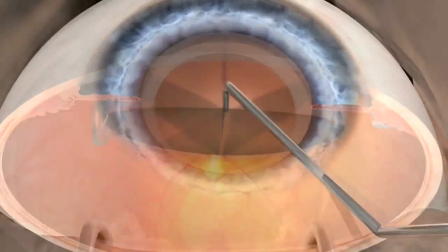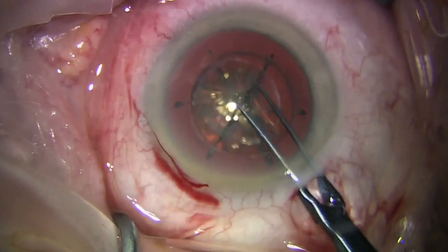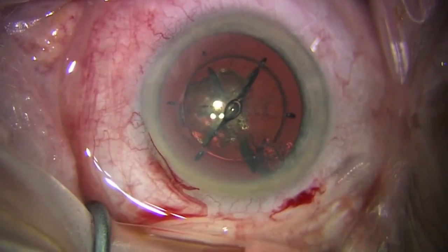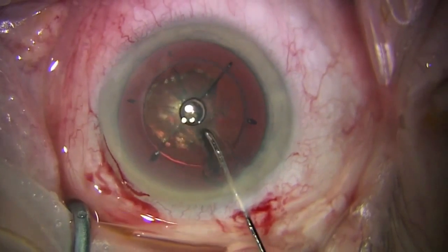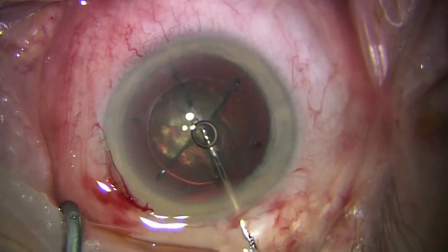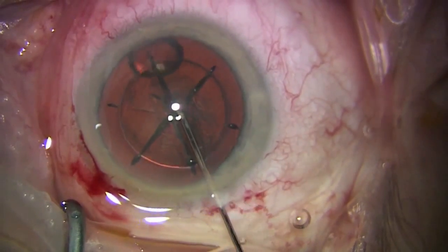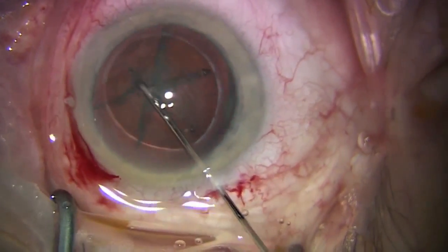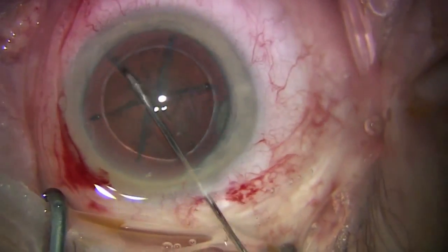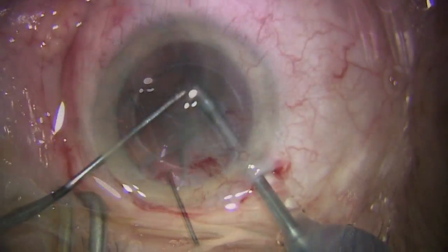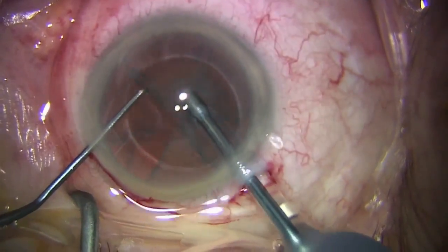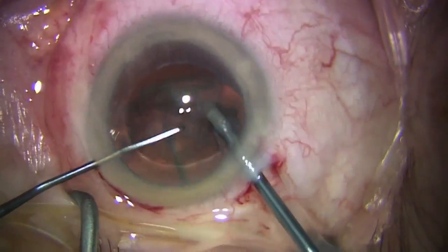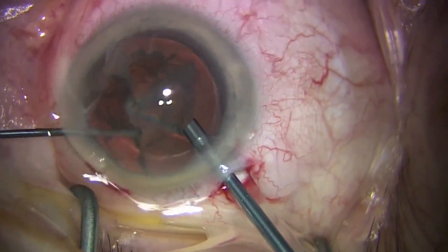Without posterior pressure, the lens is easily rotated. To demonstrate the process of translenticular hydrodissection again, the anterior capsule is removed using forceps. The cannula on balanced salt solution is introduced into the eye and inserted into the lens through one of the lens fragmentation incisions. Fluid is injected resulting in a fluid wave and displacement of the posterior gas bubble. The lens is easily rotated and the cannula is used to chop the lens further. This prior hydrodissection and lens fragmentation allows rapid segment-by-segment removal of the lens nucleus. The effective phaco time in this case of a fairly soft grade 2 lens was less than 0.1 seconds.